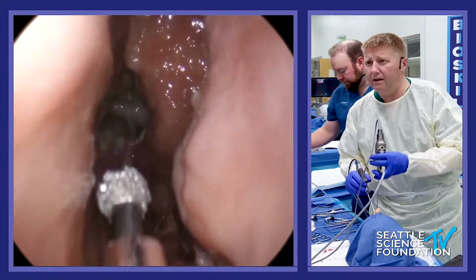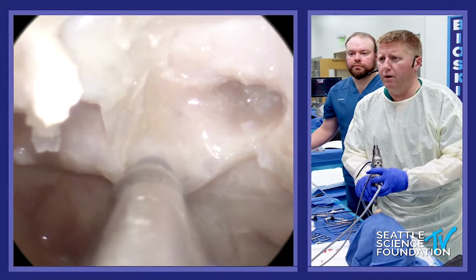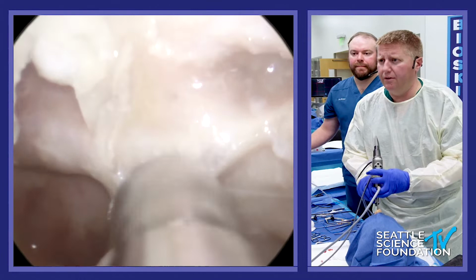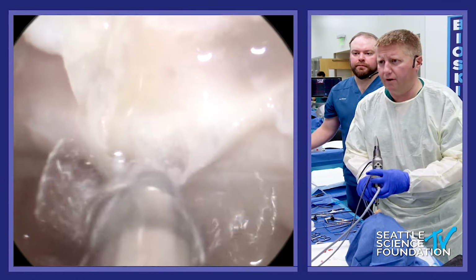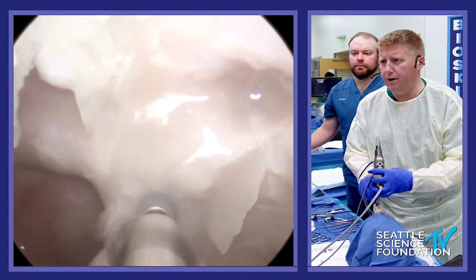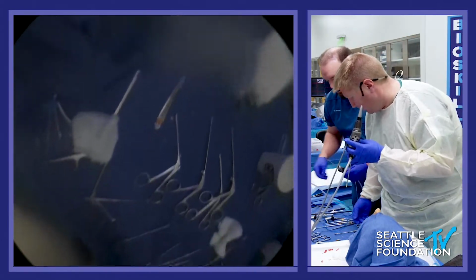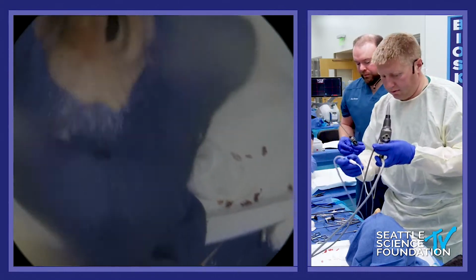And then at this point, we can go ahead and remove the bone overlying the sella. Now, this is where a diamond burr is very helpful. A cutter is going to be a little bit aggressive right here. A lot of times my neurosurgeon will be doing this. If he's not there yet, I will tend to start opening it up. I'll take the suction. Thank you.